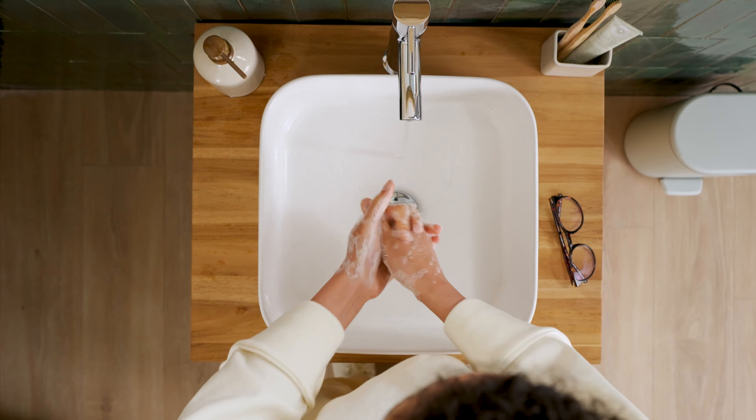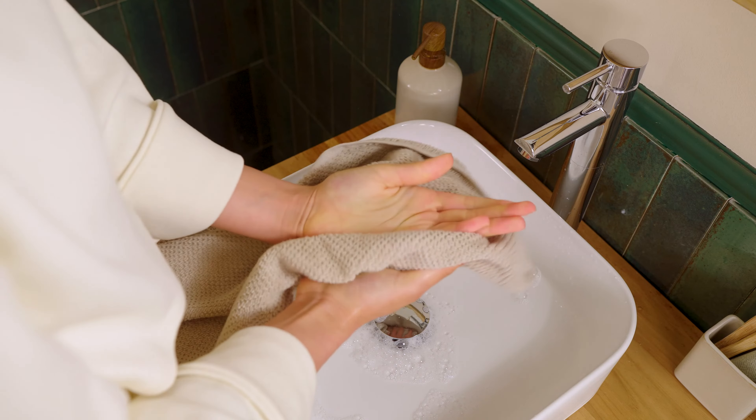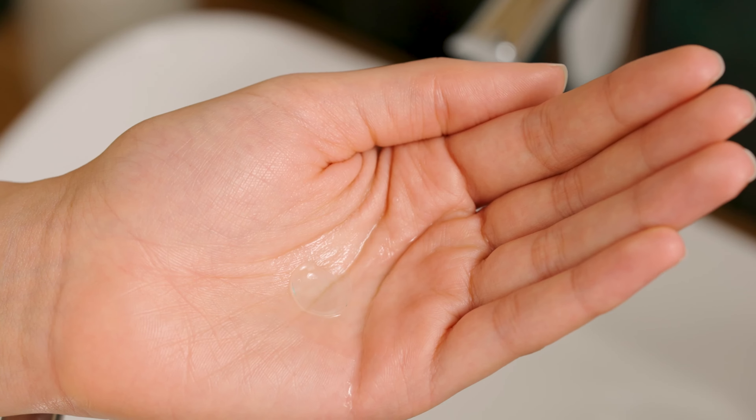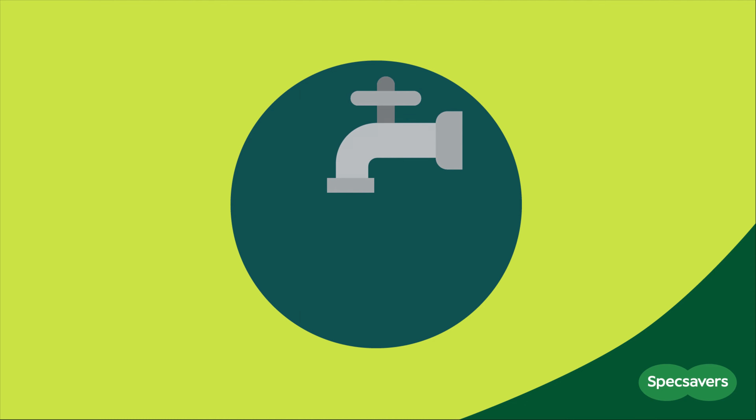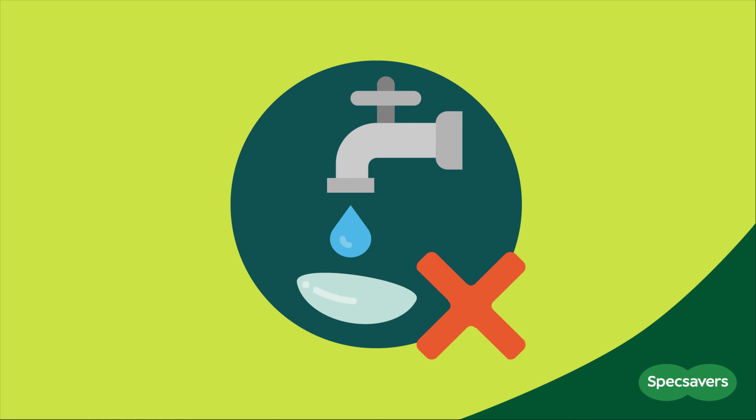Before you touch your lenses, make sure you wash and dry your hands. Then, to clean them, rinse your lenses with solution in the palm of your hand. Never use tap water, as it could irritate your eyes and cause an infection.